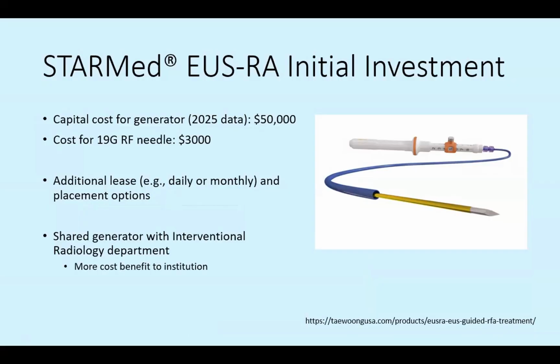One way we've used this and try to optimize the cost is our interventional radiology colleagues that are just a floor above us have the RFA generator that's compatible with this. So we're able to coordinate with them if we want to start using that. So that could be something to think about if you're wanting to look at a more cost benefit to your institution.